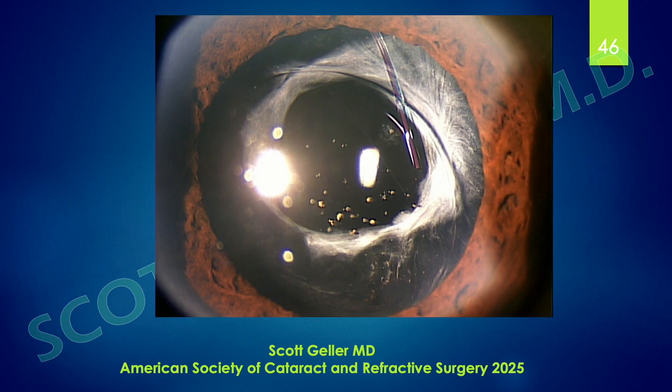I'm sure every ophthalmologist out there has seen this and maybe has done this themselves. So why does this occur? We never saw this too much with, well, this is a polymethyl methacrylate lens, but PMMA lenses seem to be much more, how should I say it, laser resistant than the acrylic and silicone lenses that are more commonly in use now.